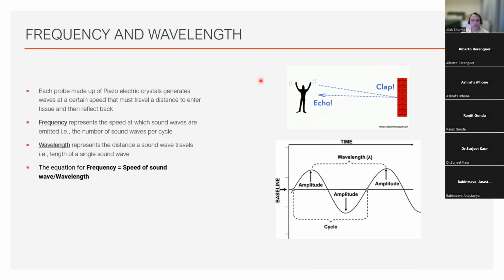So when we're looking at lung ultrasound, what we're interpreting is not necessarily tissue, but actually artifact. In certain situations where fluid becomes excessive or lung tissue gets damaged, the ultrasound waves can interact to then interpret tissue. But it's all a play of frequency and wavelength.